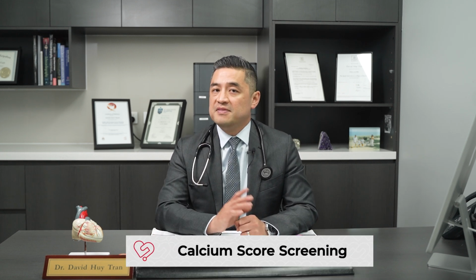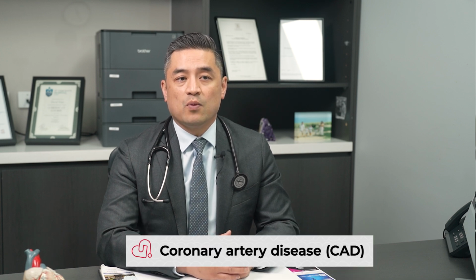There are two main components to cardiac CT scans. The first is calcium score screening. This measures the amount of calcium buildup in your coronary arteries, which is a marker of atherosclerotic coronary artery disease. Coronary artery disease is a condition where the arteries that supply blood to the heart muscle become narrowed or blocked due to the buildup of plaque.